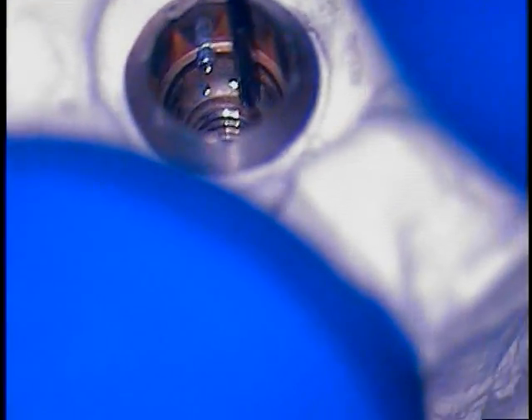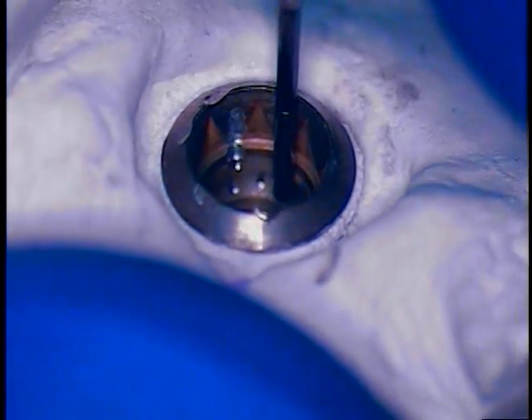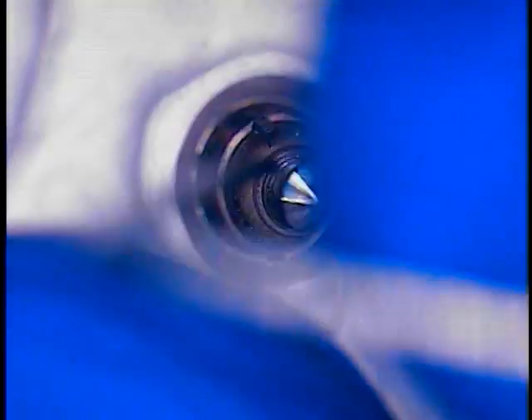We said before it's just below three millimeters. He's right at three right now — just shy of three. And if we look at our model, we're going to be just over three. So it's right there; we're just knocking on the door. You can see it's just past three — that's that zone.